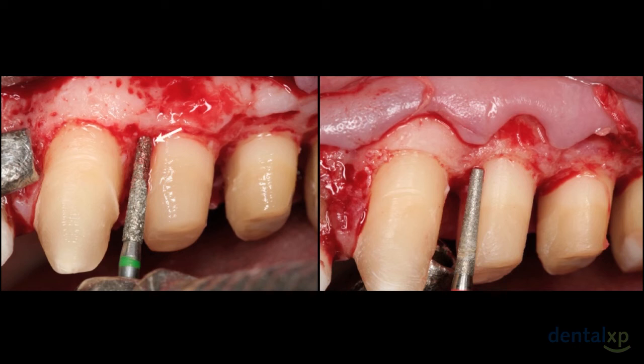Going back again, you can see where the arrow is on the left, and notice that I want to make sure that the burr is touching the bone and tooth interface and is not creating any ditching or anything that can't be corrected by the use of a diamond round burr. Now there are times you have to ditch a little bit to get the bone proper, in other words between the two teeth, but you would come back and treat it with the diamond round burr, smoothing the interproximal so that it would be a parabolic architecture.